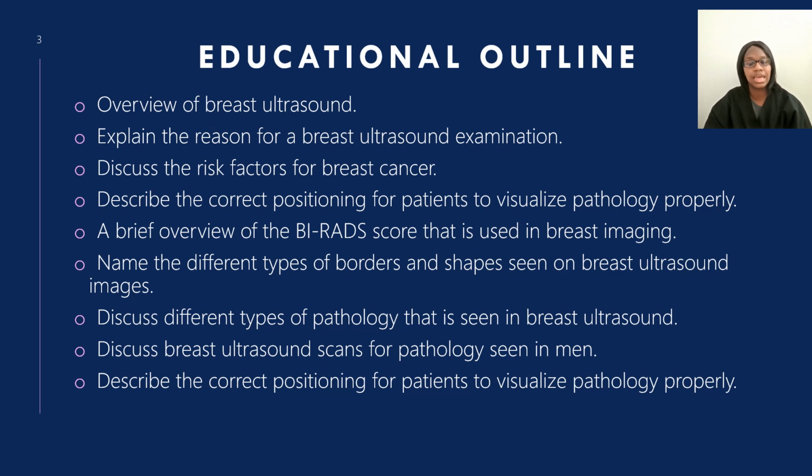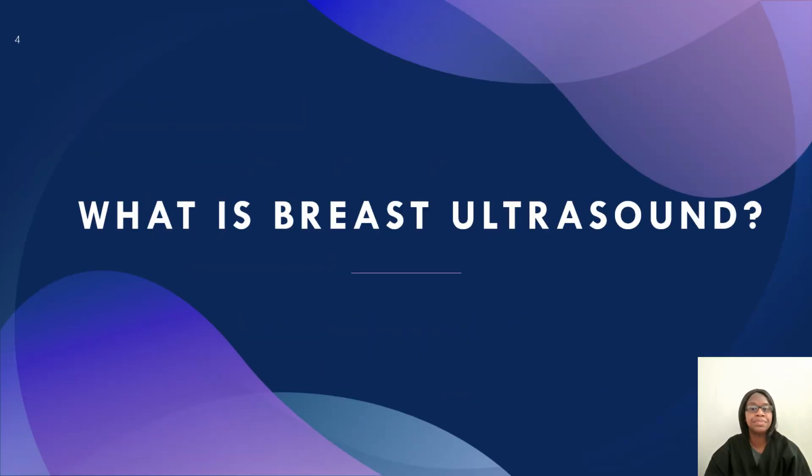discuss breast ultrasound scans pathology seen in men, because there are times where men have to come in for a mammogram if they feel a lump or if they have pain that is just bothering them and it won't go away. And then I'm also going to describe the correct positioning for patients to visualize the pathology properly.